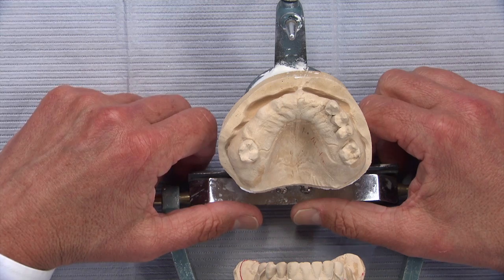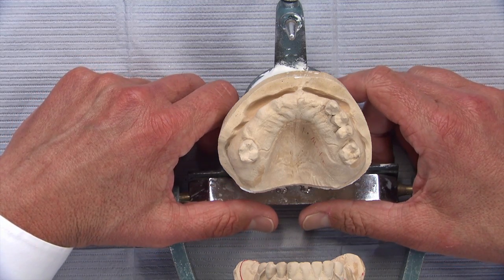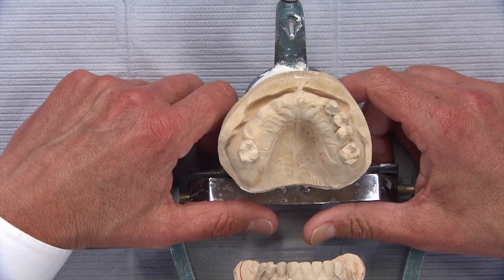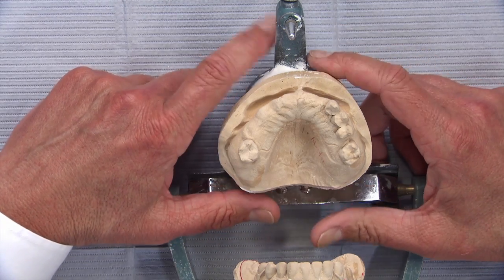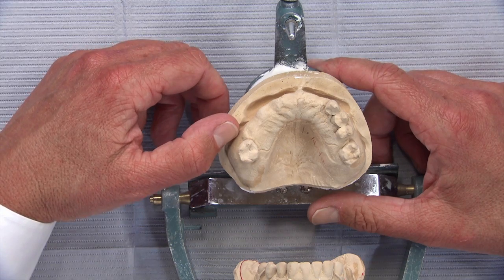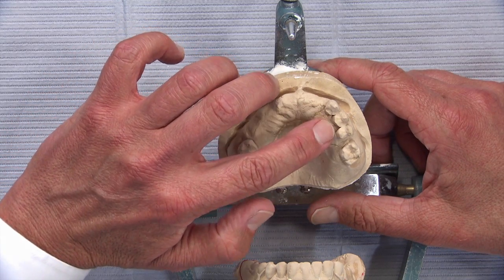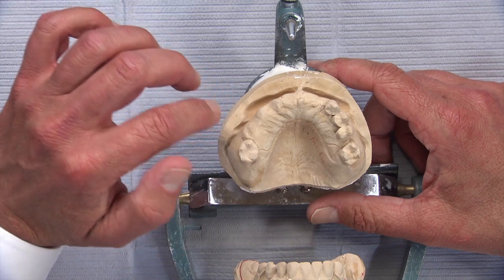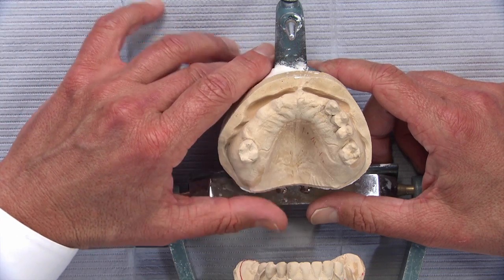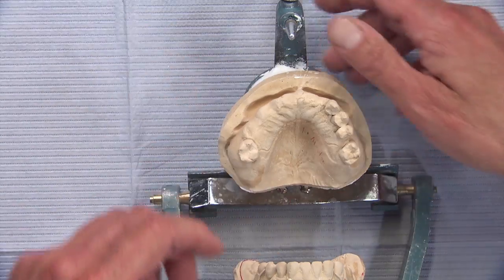I was walking through the partial denture department the other day and saw this doozy of a case. A doctor sent this one in requesting a review and a proposed design of what we could do. You could see the patient's missing teeth number 3 through 10, but has some nice rest preps from the existing partial that they had before, which is broken. In fact, it's got a history of the teeth breaking from the saddle several times.